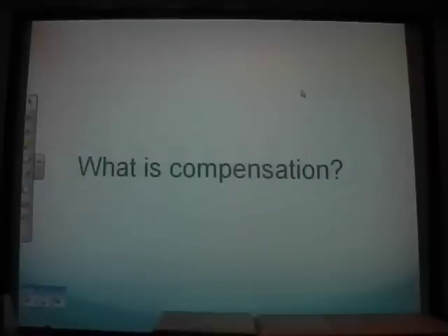What is happening? They've got high bicarbonate. Yeah, their bicarbonate would be high. Why would it be high? To get rid of the acid. Yeah, so in acid-base disorders, if it's a respiratory component, then they're not being able to blow off their CO2, they're retaining it.